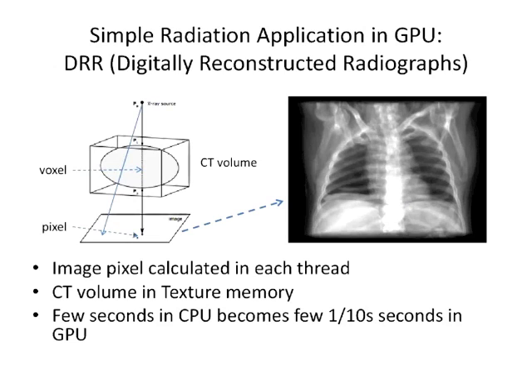We could take advantage of NVIDIA's three-dimensional hardware interpolation scheme, which we would have had to do in software in other products. We could take advantage of some of the features that NVIDIA CUDA was providing.